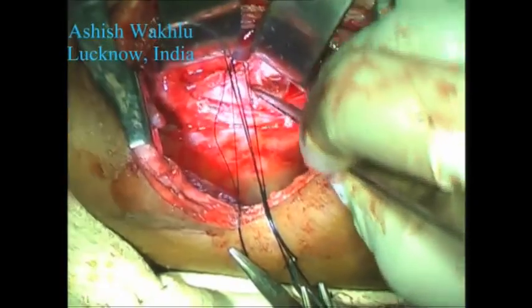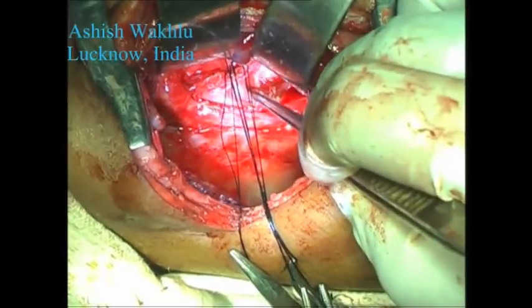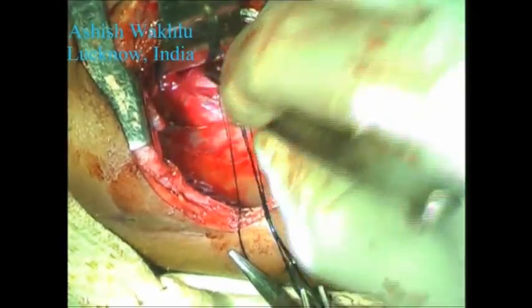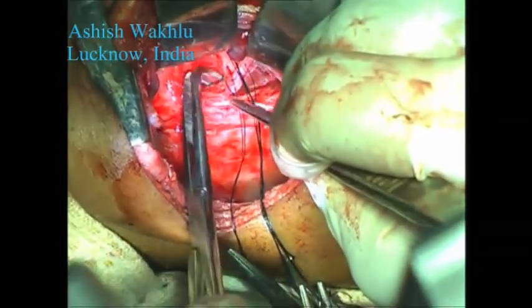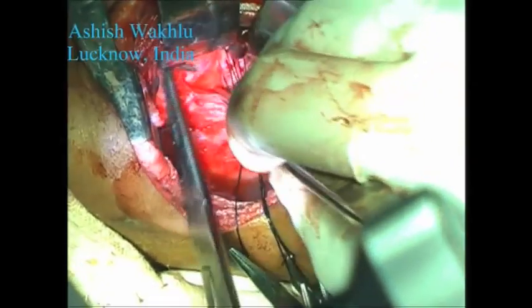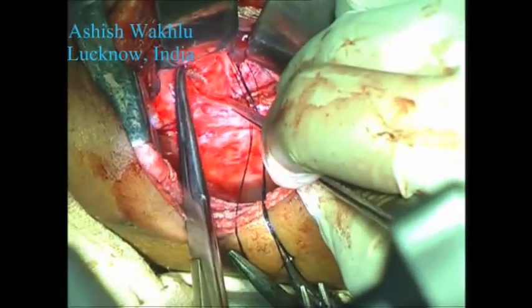We are now dissecting the mediastinum just underneath the hilum of the lung to locate the trachea and the stump of the right main bronchus, which will be anastomosed to the bronchial bifurcation at the lung hilum.